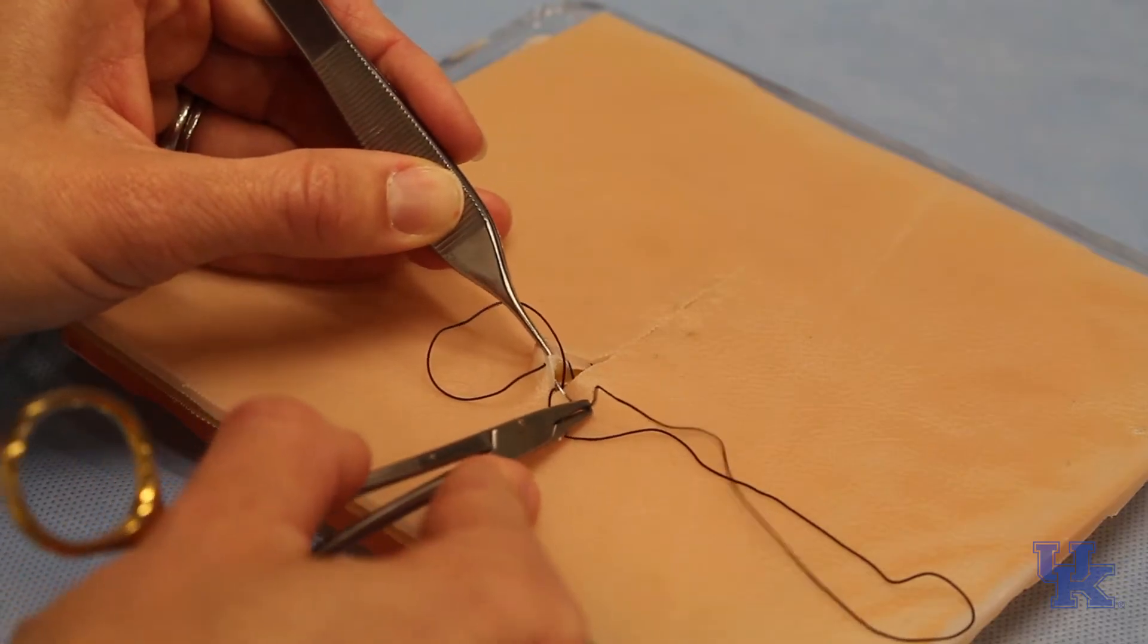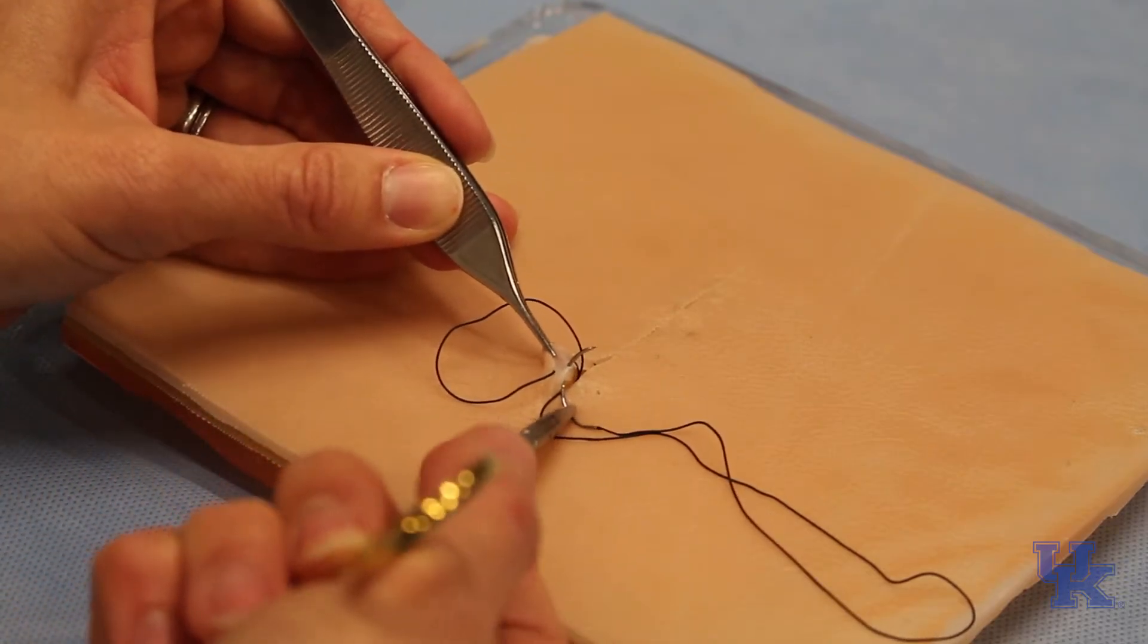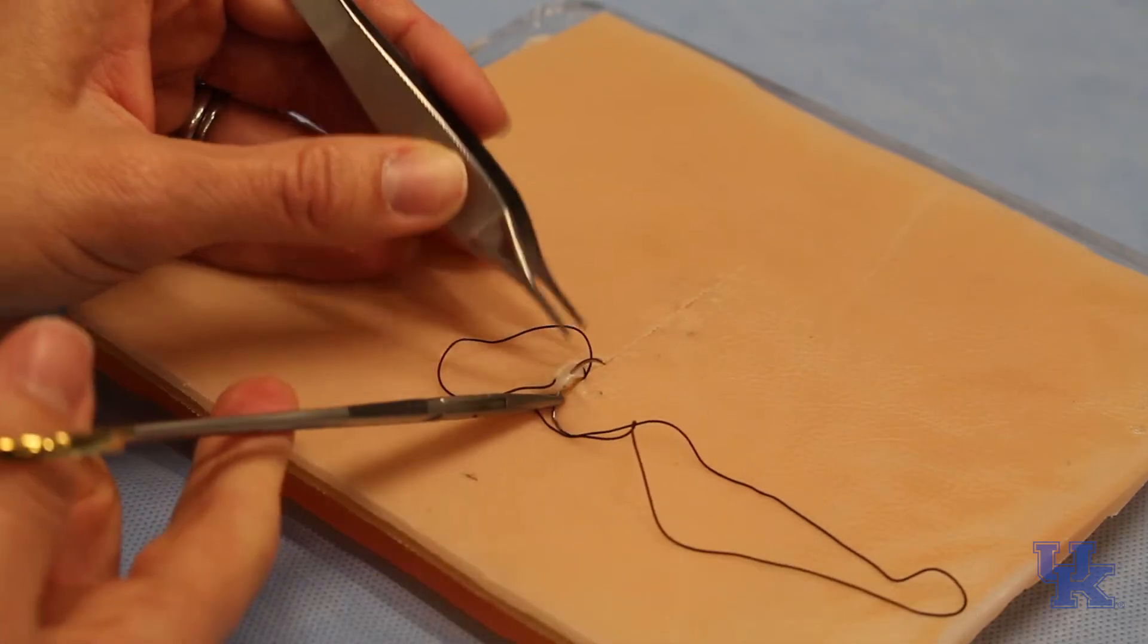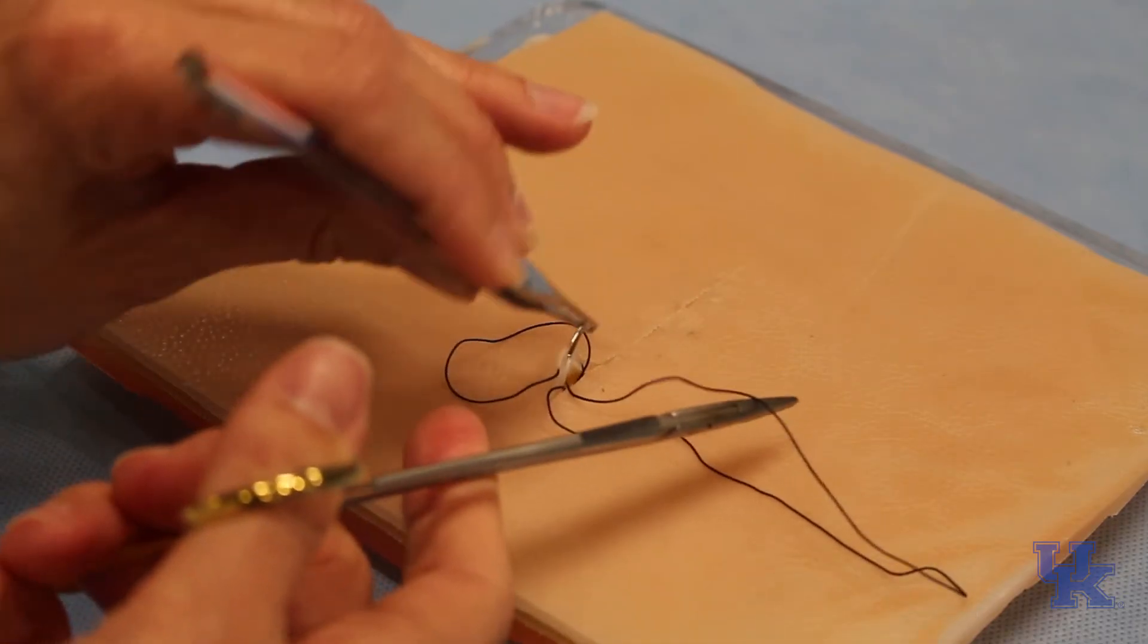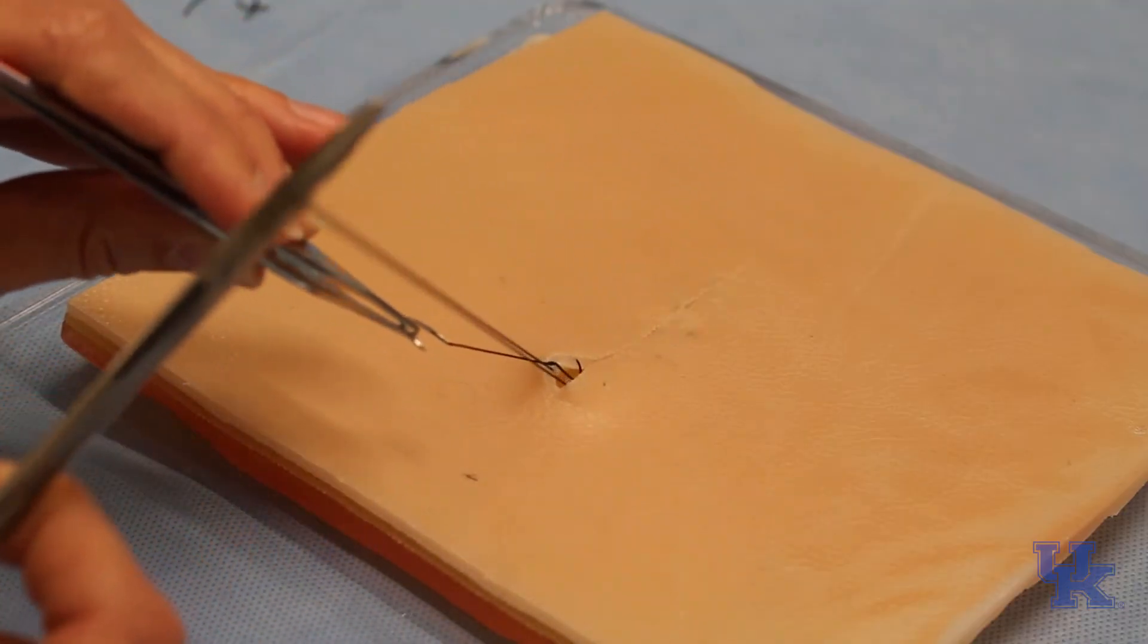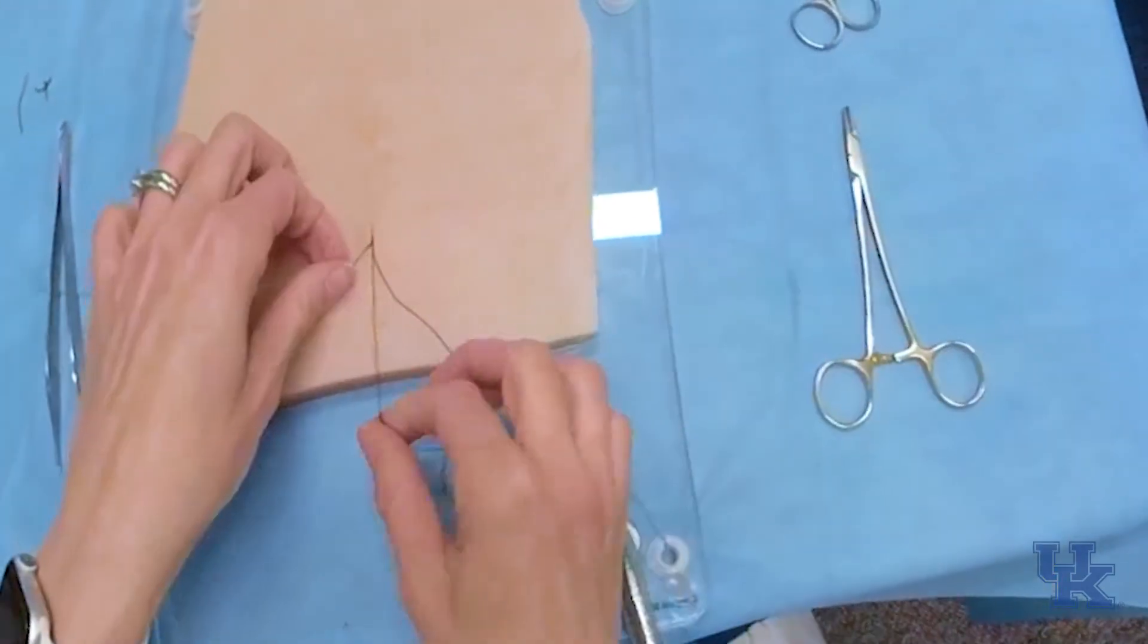So what I like to do is grab a whole bite that's just deep. You see that's all deep. It's all in the dermis. Nothing's right up at the skin edge, and I pull that through. Now all three of my sutures are coming from deep.